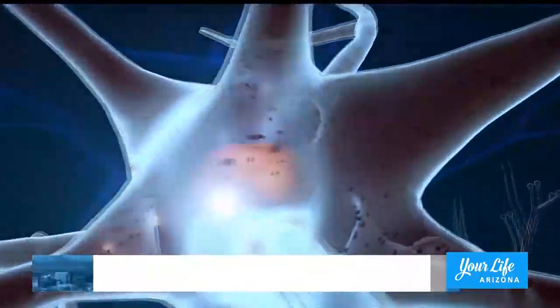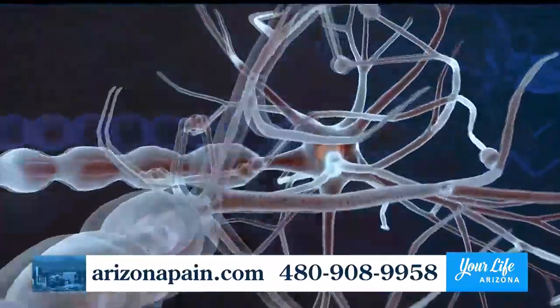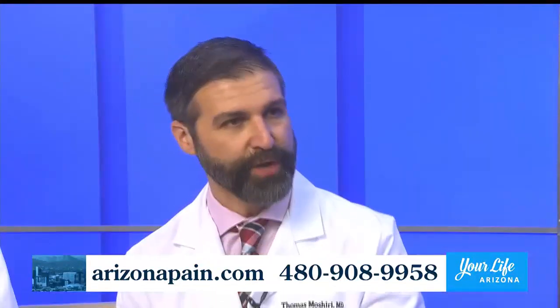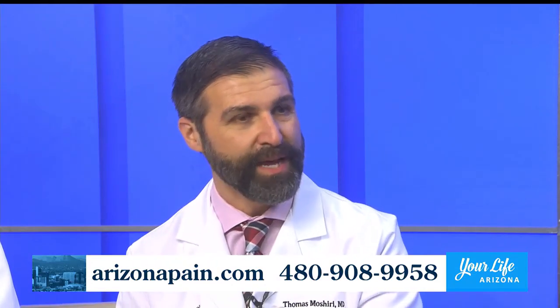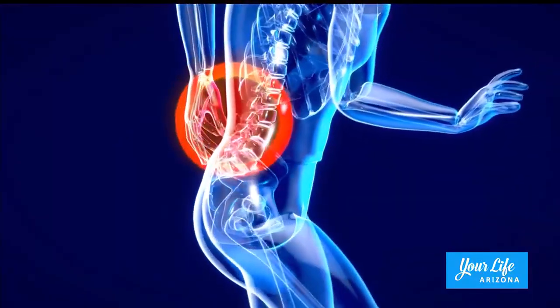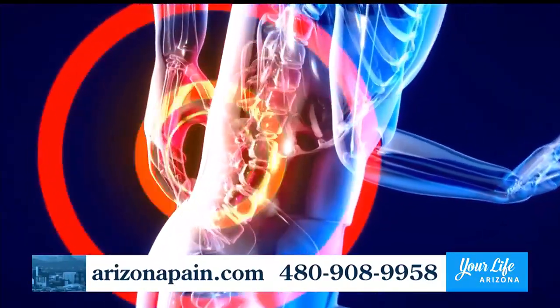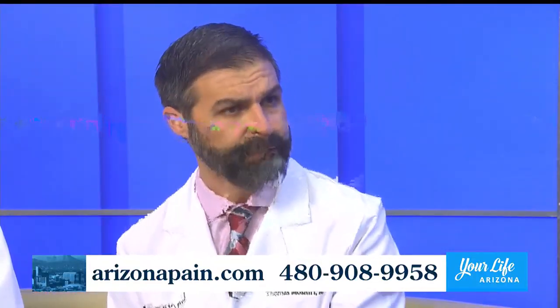But the problem is that when you burn those nerves, they cease to conduct signals, but they also get damaged in the process. And as they get damaged, and as your body tries to heal that nerve, the process restarts. But now sometimes it's even worse, because now you get scar tissue in the area, and so the problem continues to get worse over time. And it doesn't seem to last as long either. So the pain relief you get from the radiofrequency ablation becomes less and less effective over time.